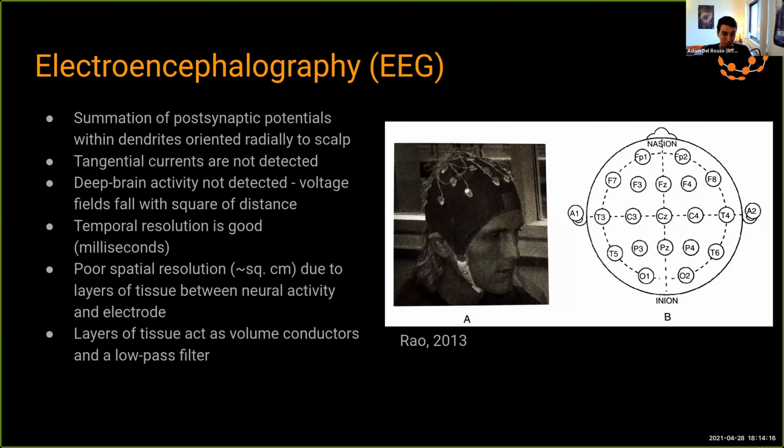So now, how do we record? How do we pick up information from the brain? And this is where electroencephalography, EEG, comes in.